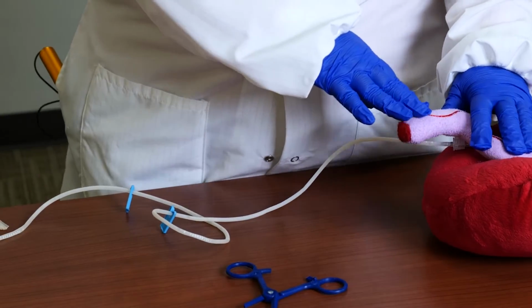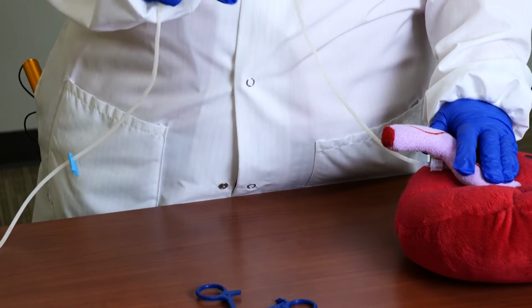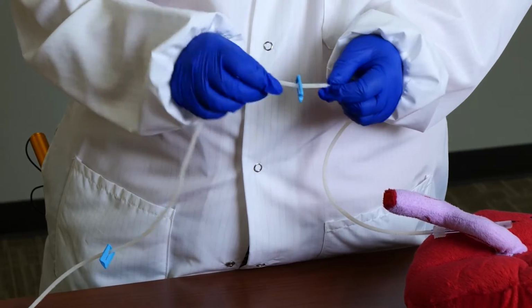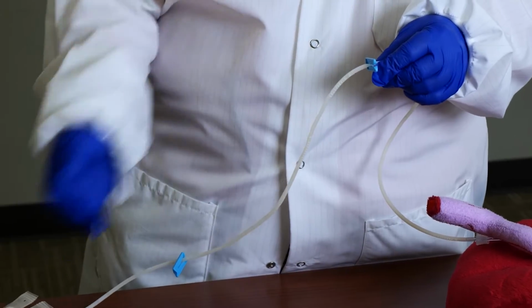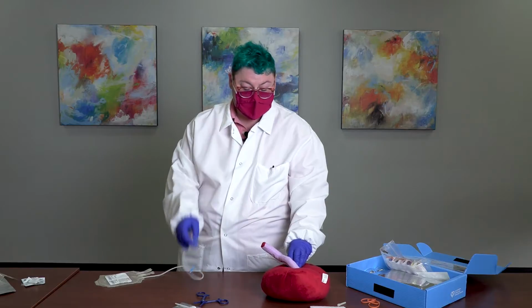After the cord has blanched white and is no longer pulsing, you'll go ahead and slide one of the blue clamps over the tubing line, and this will prevent any of the blood that's in the collection bag from getting out, and it'll prevent air from getting into the collection bag. At that point, you'll be ready to remove the needle.